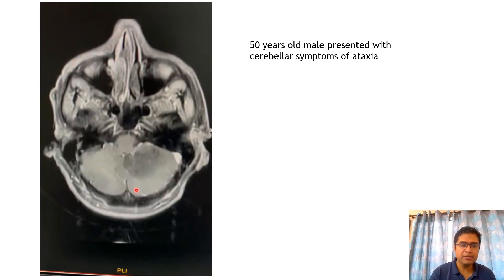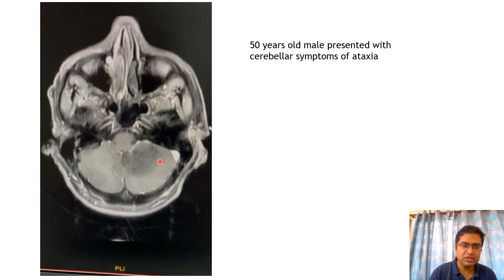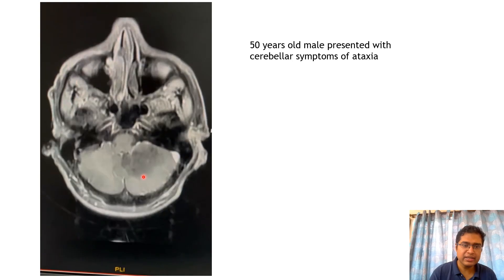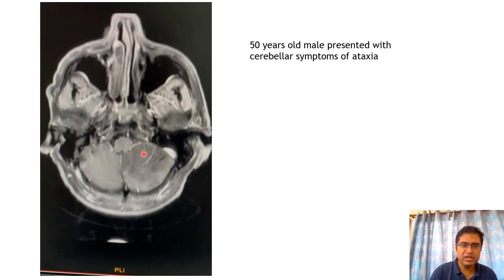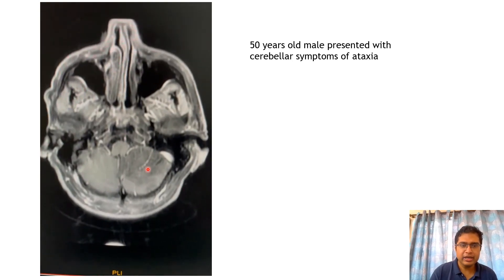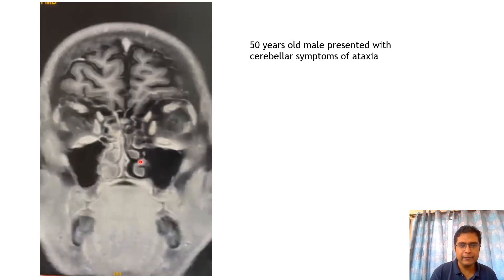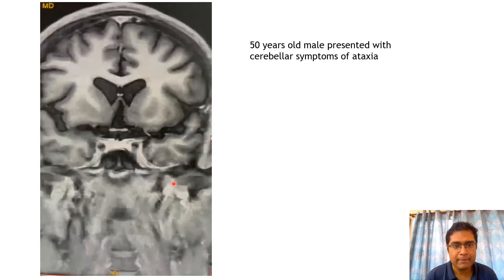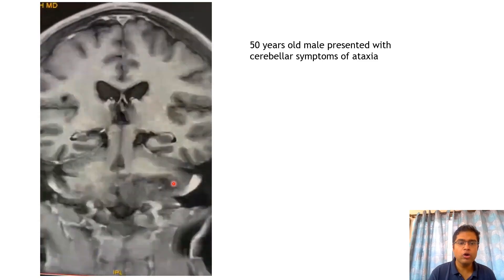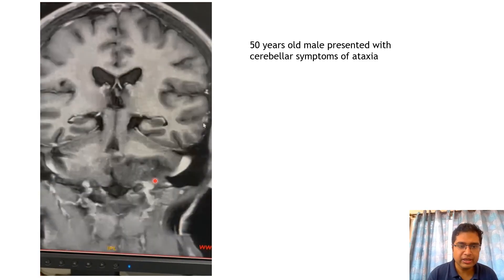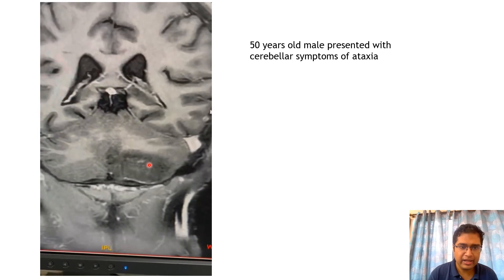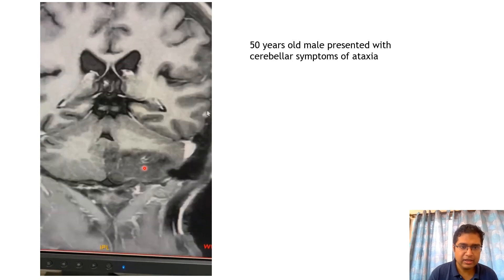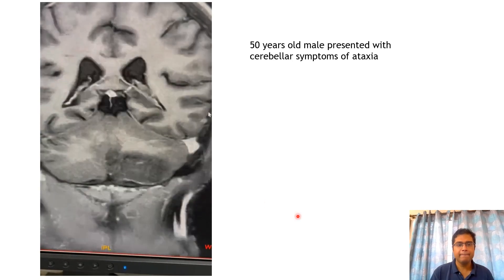On post-contrast images, we can see subtle leptomeningeal enhancement in that particular area. These are the coronal post-contrast images showing this subtle enhancing area.